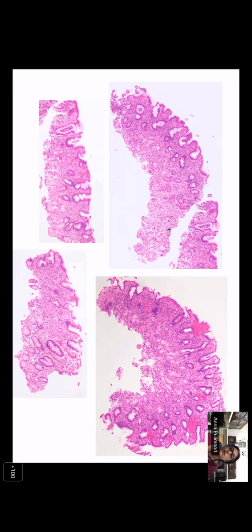That's also a message to know that often when a clinician takes a biopsy from an ulcer, the ulcer may not appear in your mucosal fragments because the scope sometimes slips. So often they may not give you the ulcer, but often it's more useful to have the mucosa adjacent to the ulcer, because that gives you the clues to what it is. So now you have described correctly that there is some inflammation. There seems to be some architectural alteration.